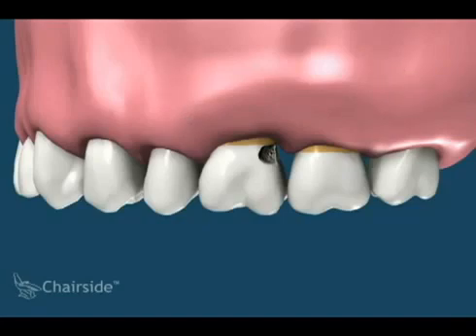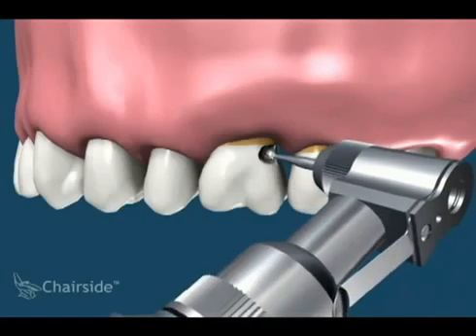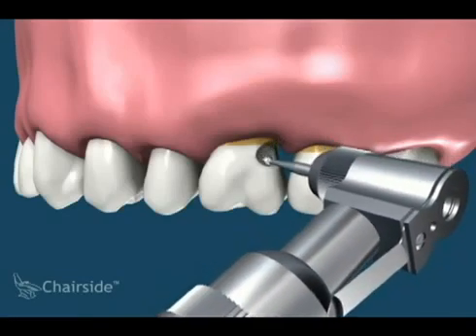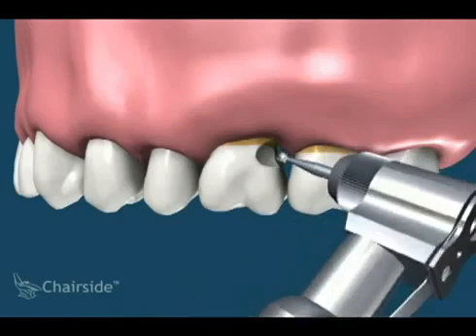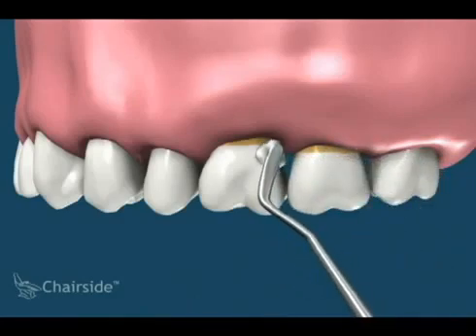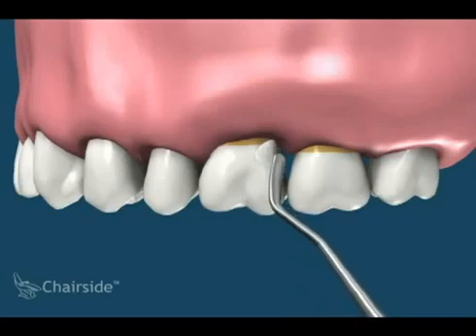The cavity can now be accessed. In this situation, a resin filling is used to restore the cavity. The cavity is accessible and removed, followed by the resin placement. The reason the procedure is called crown lengthening is because the crown tends to look longer after the procedure.